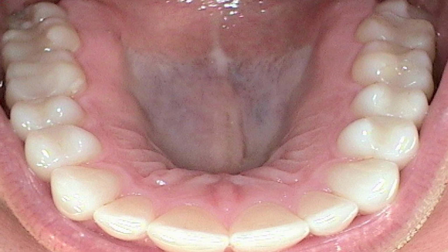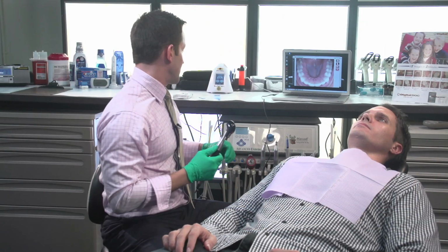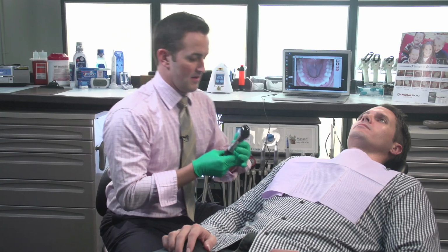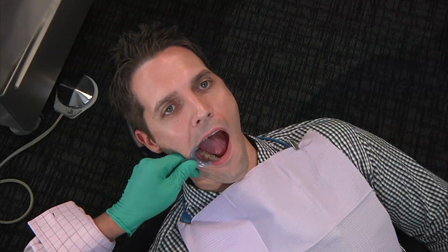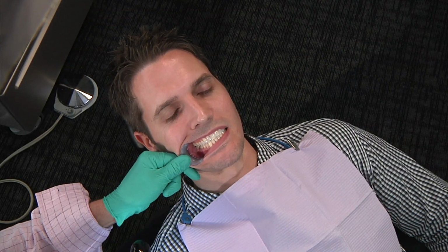Perfect. Now we're going to do the buccal shots. We're going to use basically a single retractor. You're going to go ahead and choke up on the retractor and position the camera against your thumb. Have the patient open up for me. Insert, have them close down. Now we're going to pull back and out just a little bit.